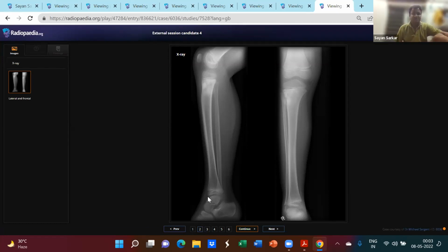What is the age of the patient? In a 6-year-old patient with a metaphyseal lesion having a wide zone of transition, I would be concerned about a few entities, Ewing sarcoma and osteomyelitis to begin with. Why Ewing sarcoma to begin with? Because it has a wide zone of transition. The patient is a young person.